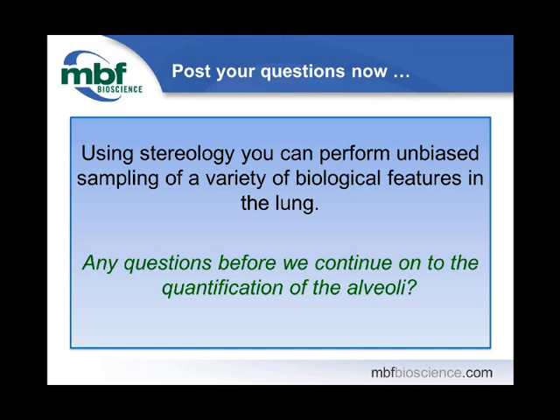And so let's continue that conversation. Get in touch with me, get in touch with us. We can help you not only follow the rules for these probes to eliminate bias, but also we can help you think about how much sampling to do, and it's really going to depend on what precision you need and how homogeneous or heterogeneous your feature is that you're looking for.